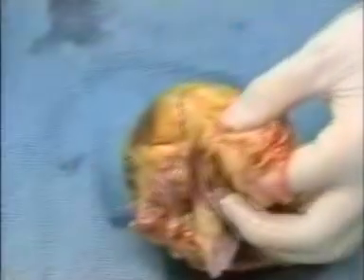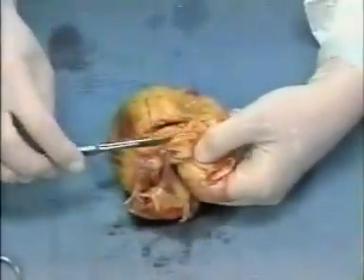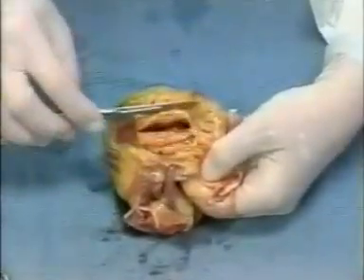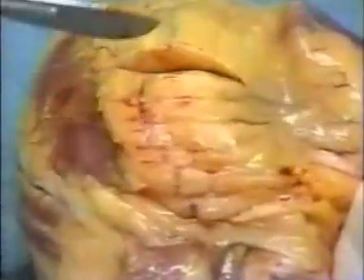Dr. Fricke's now examining the heart. The first thing she'll be doing is looking at the coronary arteries to make sure that they're intact and that there's no signs of thrombosis or atherosclerosis. The artery she's dissecting right now is called the left anterior descending artery. This is the vessel that supplies the anterior portion of the left side of the heart, or the main pumping chamber of the heart.